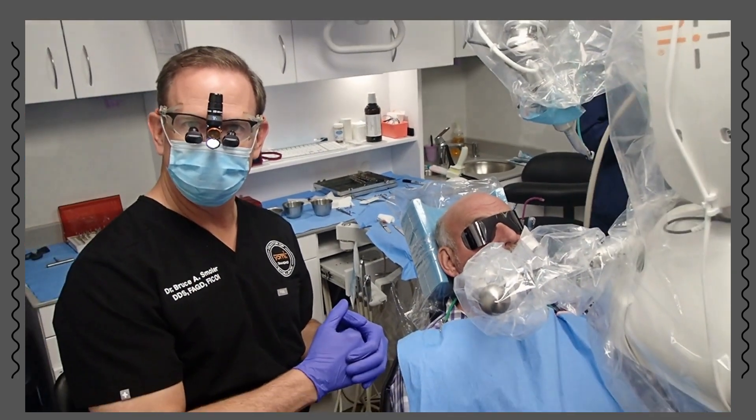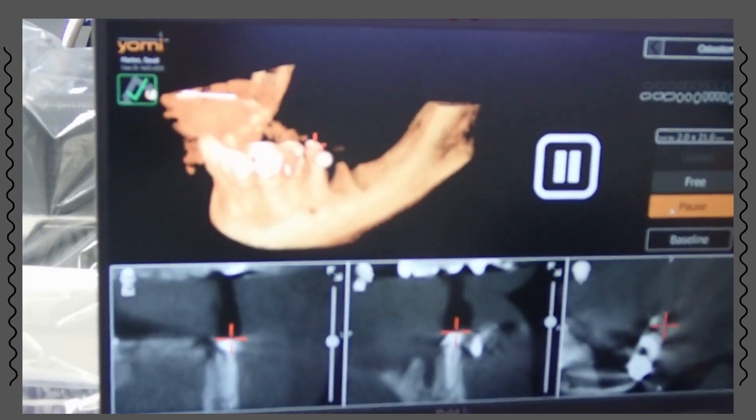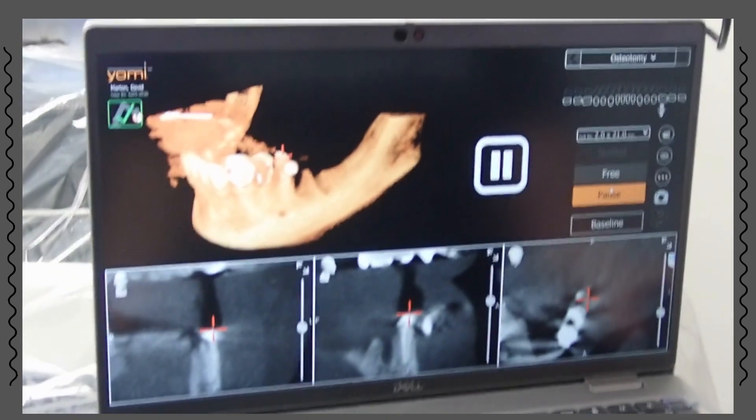We slide it over for the horizontal and slide it up and down for the vertical. Locking him in place. Face line to the right. 2.0 by 21 — yes, 2.0 by 21.